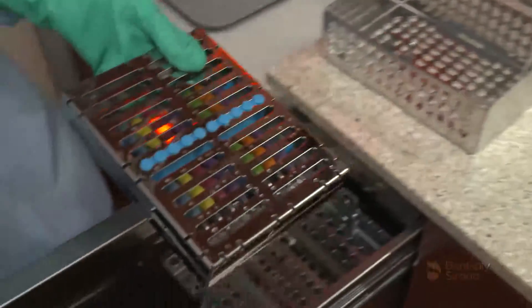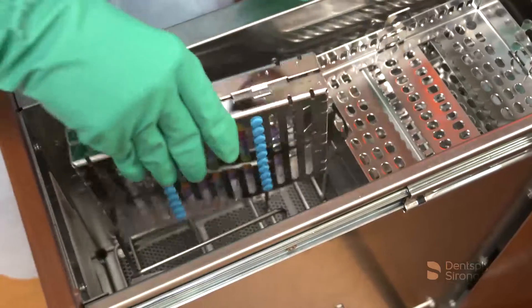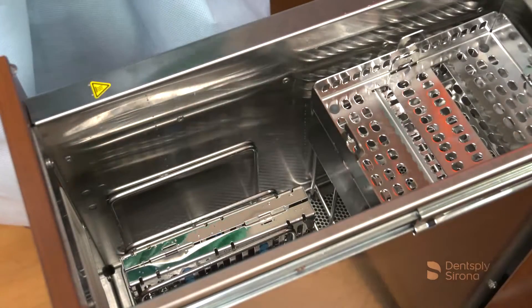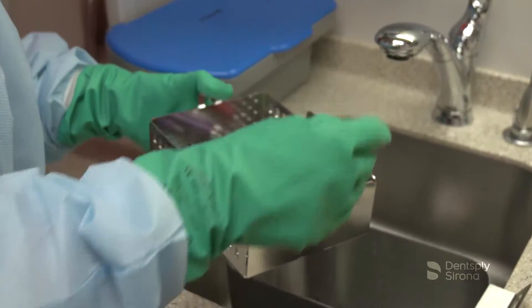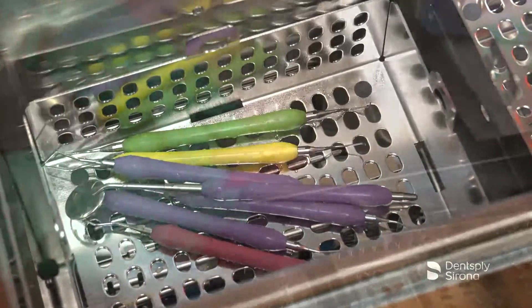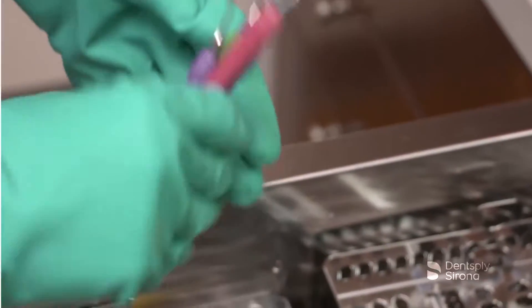Drying instruments completely prior to sterilization will protect the instruments from corroding. Leaving a Cavitron ultrasonic insert wet before the final sterilization step may cause the insert to become stained, corrode, or clog the water ports. As demonstrated here, the use of an instrument dryer can accommodate cassettes as well as loose instruments placed in a basket. Once instruments are dry, they should be inspected prior to packaging and the sterilization process.